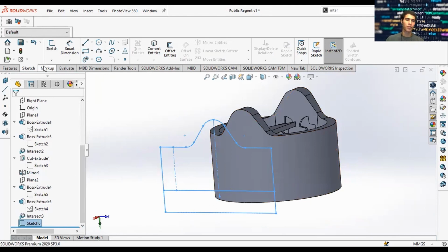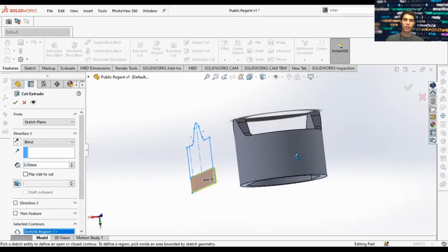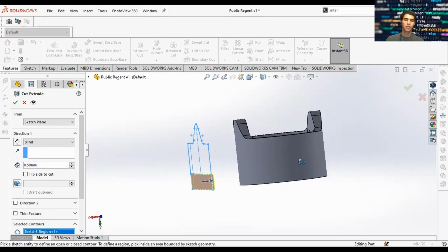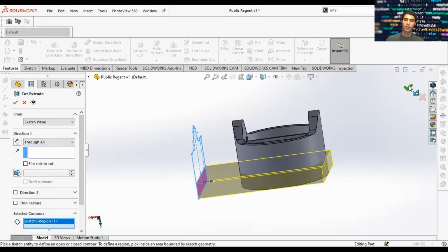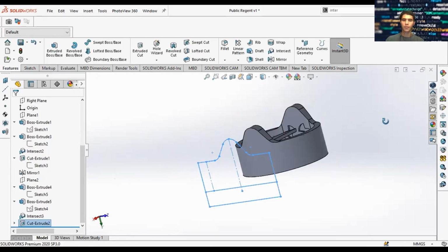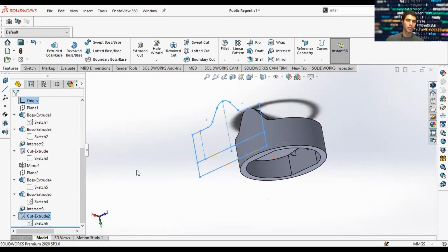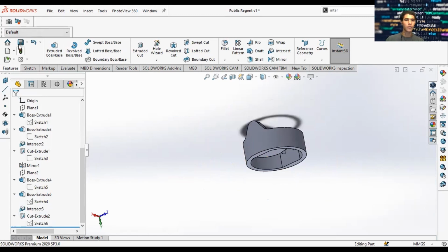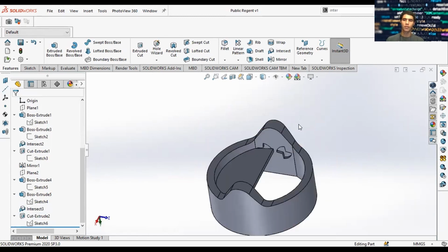And what we're going to do with this side profile is we're going to extrude cut into the body. We want to extrude cut this bottom profile that's excess, so we can achieve that 13 millimeter height requirement. So I'm going to extrude through all and remove that portion. And it's gone. So let's hide our sketch. Do a quick save. And now we can focus on making this look nice.